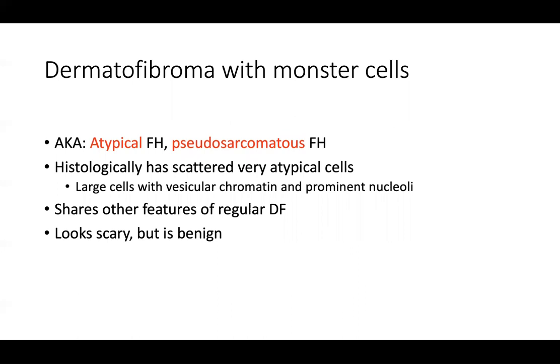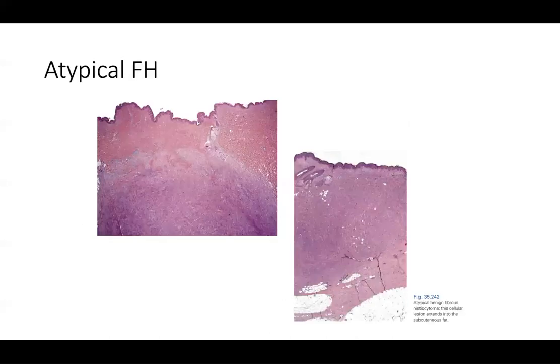But again, in terms of malignant versus benign, it's considered more benign, but it's an atypical FH. And so for me, if I see these things, I comment on the margins and I say that recurrence is very likely. And, if clinically feasible or appropriate, conservative but complete excision should be considered with negative margins.